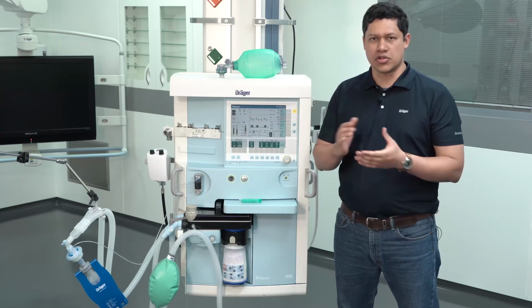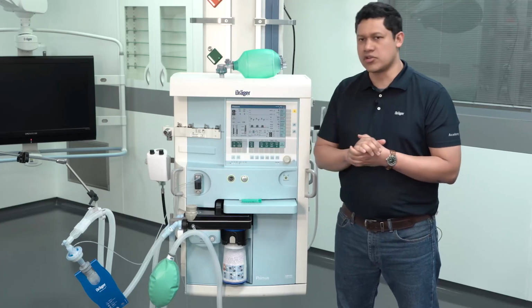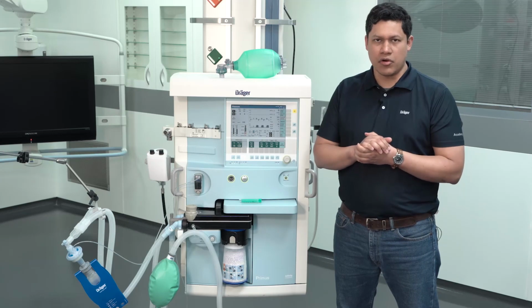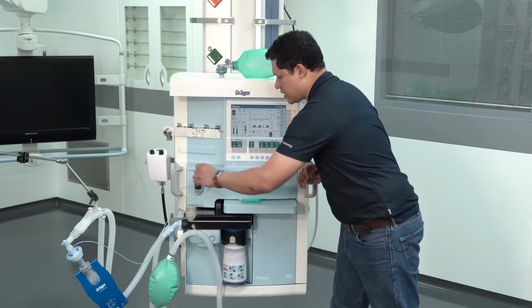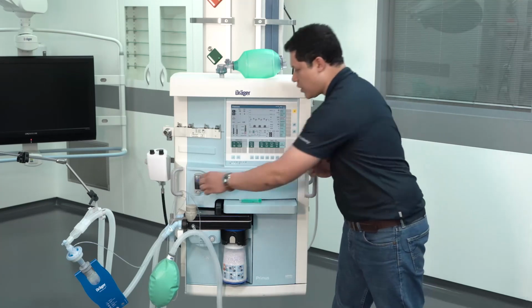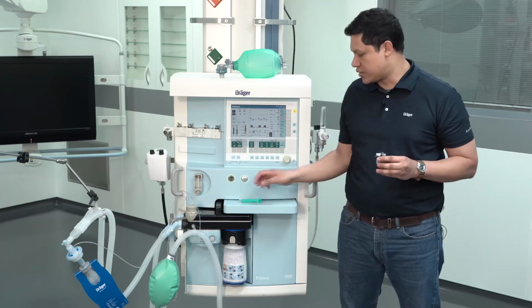To check the condition of the gas measurement water trap, visually monitor that no more than half of its content is full. Otherwise, you have to drain it. To do so, first disconnect the sample line, then detach the water trap from the port, and use a standard syringe to drain it.